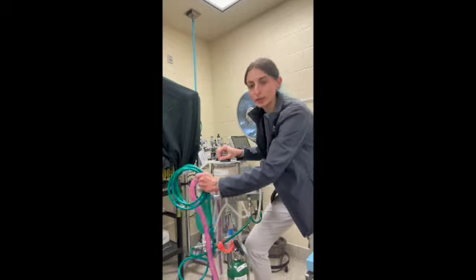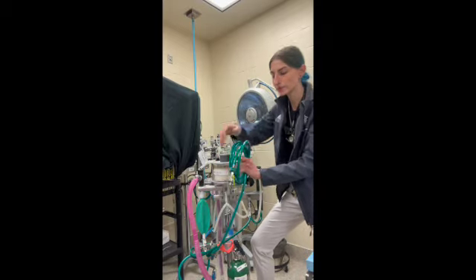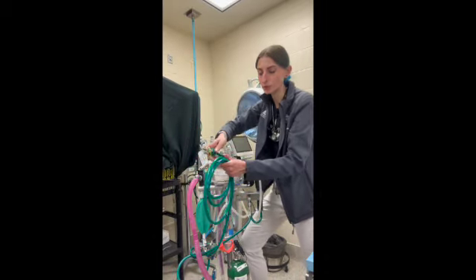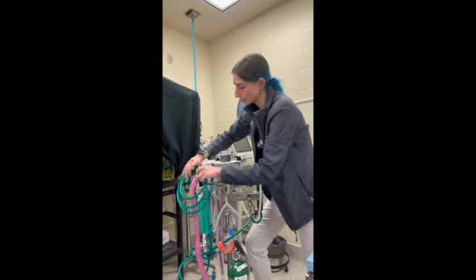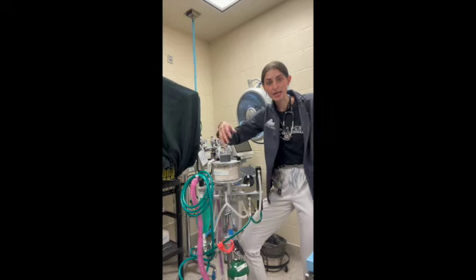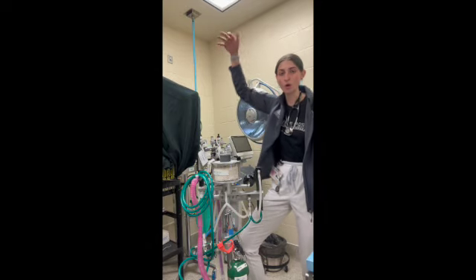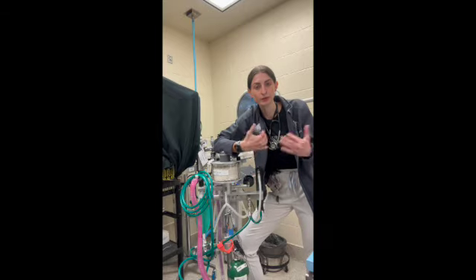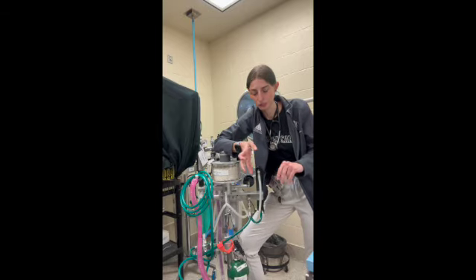We do have an additional oxygen hose, and this can be directly connected to the oxygen that is supplied to the rest of the hospital. Those are typically connected to the giant H tanks that are about this tall. Those are in a separate room that has special keys, so unfortunately I cannot show you the big H tanks.